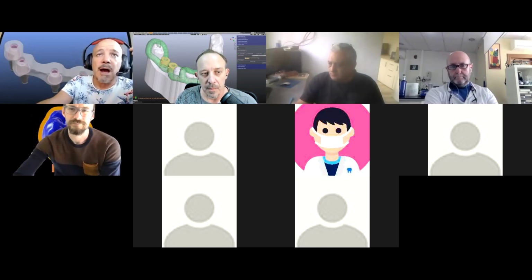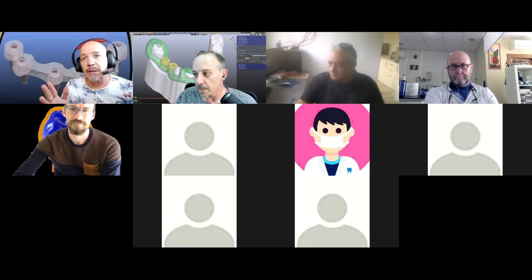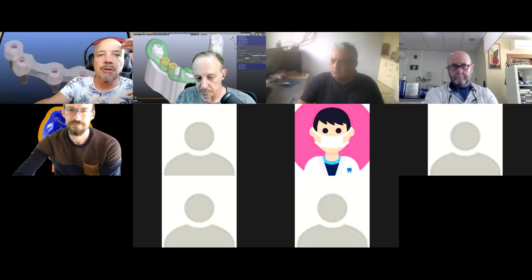So I've made videos to a certain point, like a tutorial, and now it's the custom abutments, which I'm still developing a bit, and then we're going to finish it. We're going to have the whole thing in a long tutorial. Okay, thanks, Wolfgang.